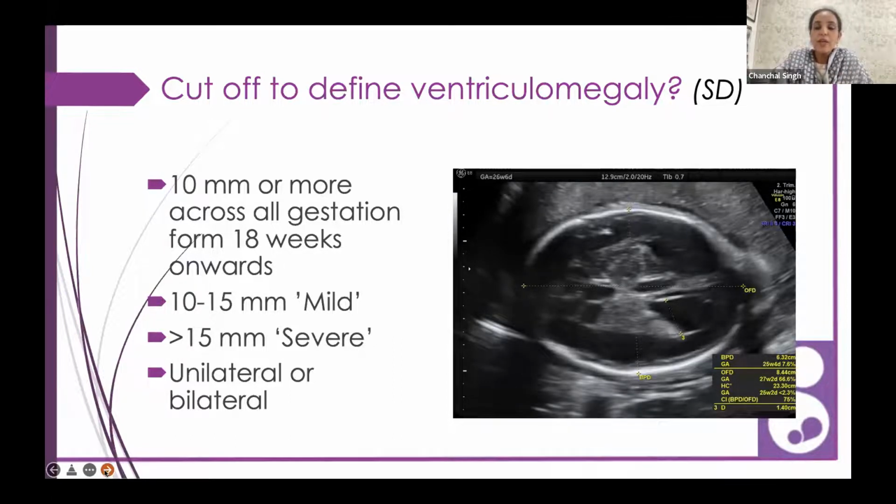When we are talking about a ventriculomegaly of more than 10 millimeter being associated with chromosomal abnormalities, it can happen on any side, and one is able to do it easily on the scan. So one should measure both, and the asymmetry is relevant only when one is more than 10 millimeter. So if both ventricles are 7 and 8.9, that is okay.